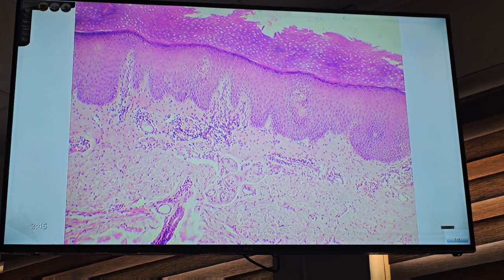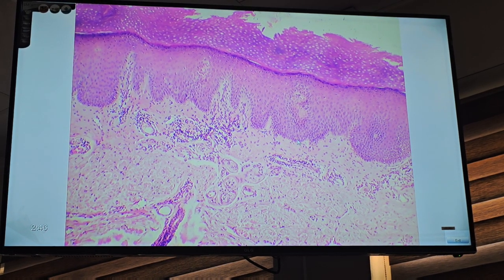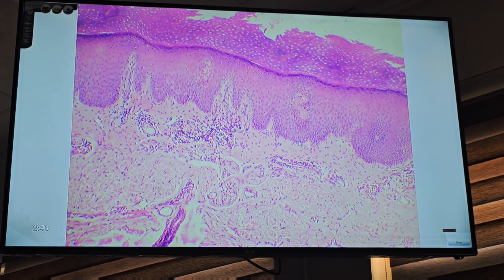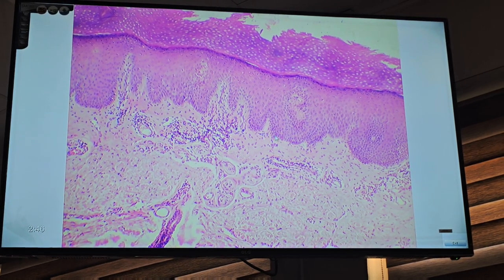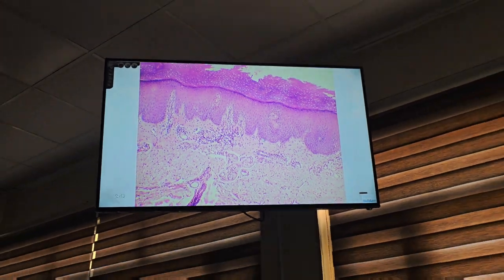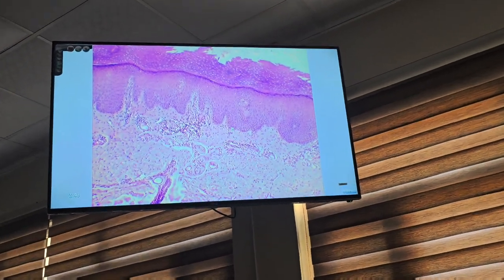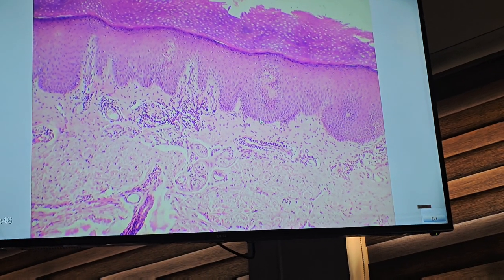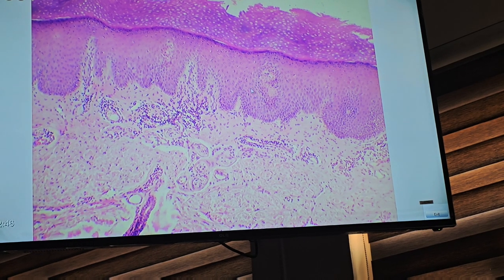These cells are also called stem cells. They have the ability to divide by mitosis and are responsible for renewal of the other cell types. Stratum basale or the basal layer.